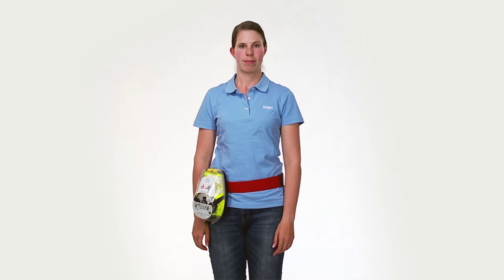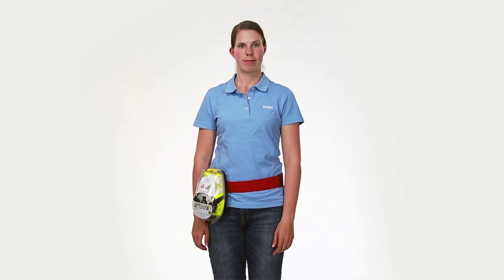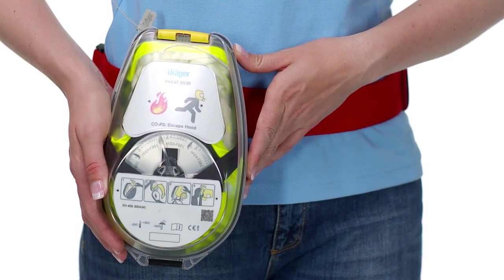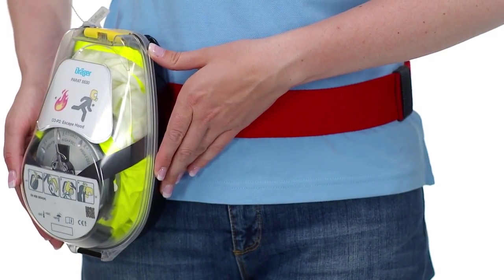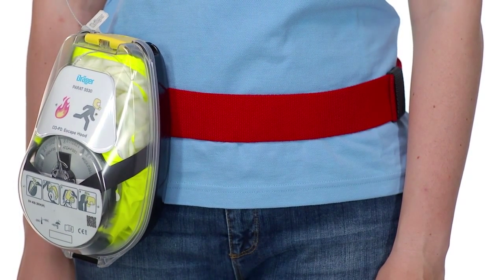The Parat hard case is a robust case which reliably withstands the strains of wind and weather. The hard case is sufficiently sealed and has an IP54 splash water protection level. In the case of an accident, the Draeger Parat escape hood inside the hard case can easily be opened, removed and donned.